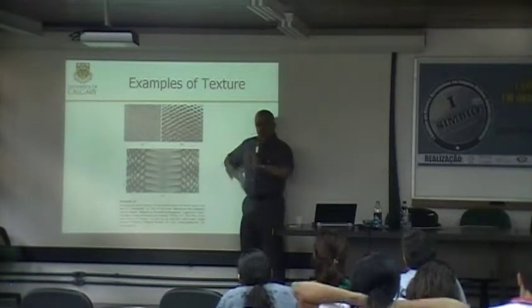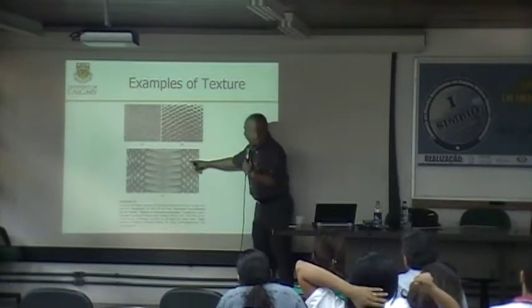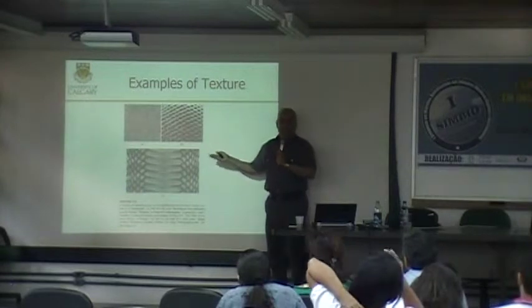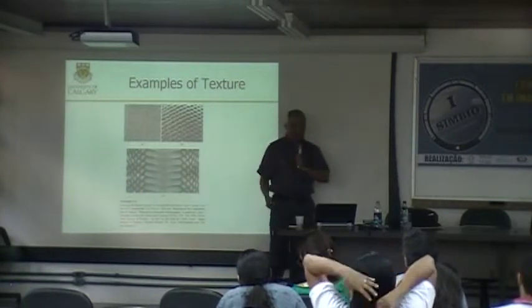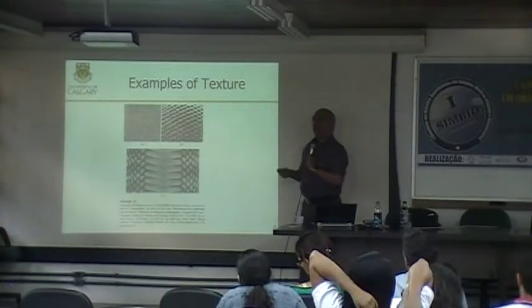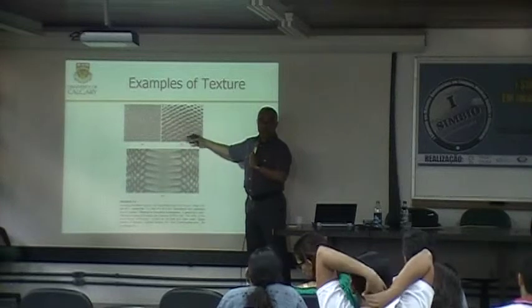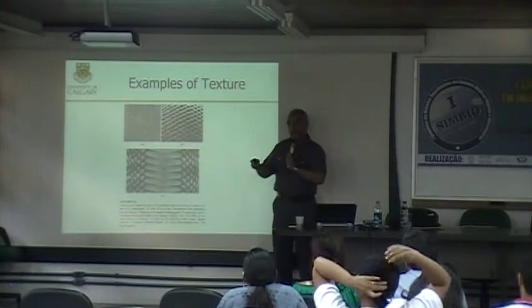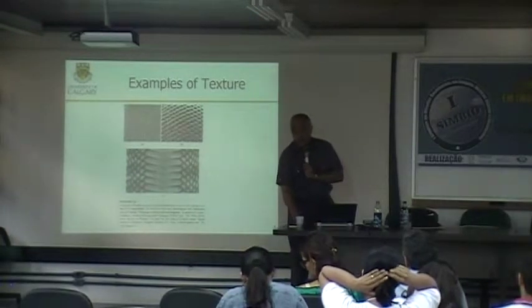This, it's the projection, the curvature of the belly of the snake. So maybe these are all the same, but with the curvature, the image is distorted. So this is also periodic texture. So there are many biological entities naturally exhibiting regular periodic texture or random texture in medical images, depending on how the images were obtained.